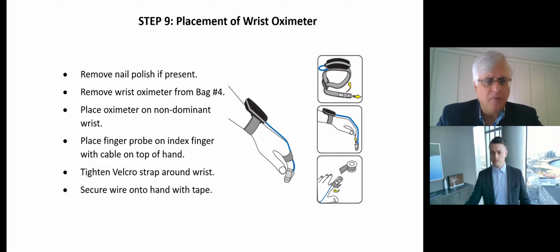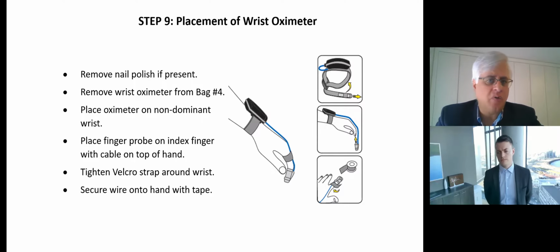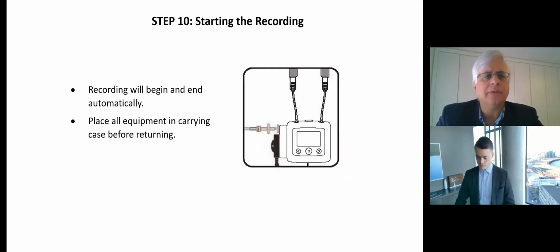One has to be very careful which AA battery to use because different types of AA batteries have different drain rates. And we've noticed that with a lithium AA battery, we can get about 8 to 12 hours of recording of the entire montage with regards to one individual. So there's enough charge on one AA battery for us to last a full night of recording.